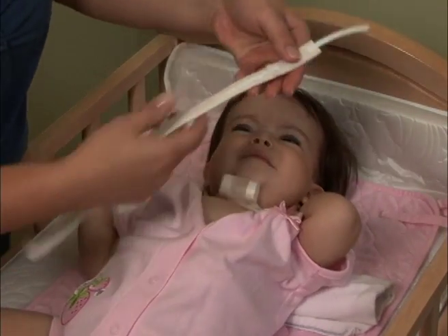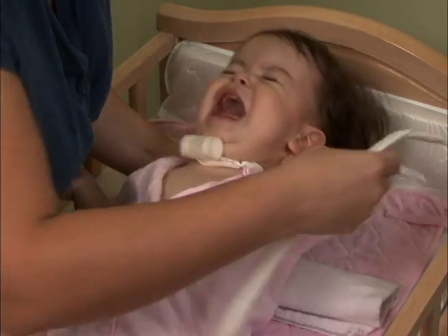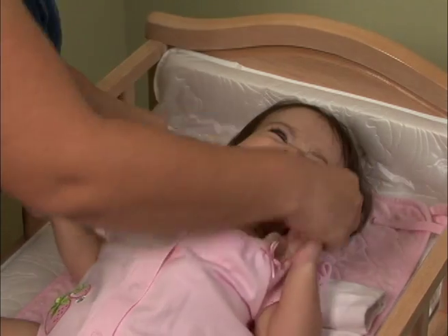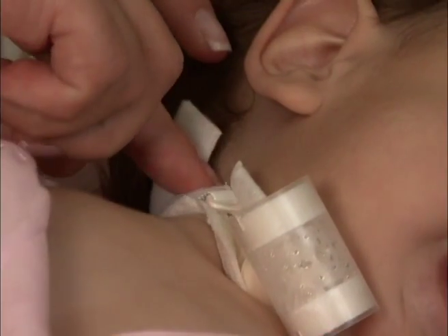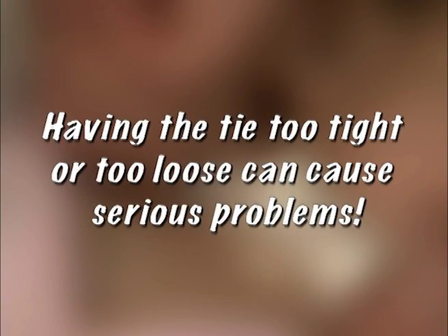If you have the two-piece trach ties, you will have to size the trach tie by cutting off the excess. You can measure your child's neck with a measuring tape or by simply holding the trach tie around your child's neck and sizing it up. The proper fit should allow for one finger to fit between the neck and the trach tie. Having the tie too tight or too loose can cause serious problems.